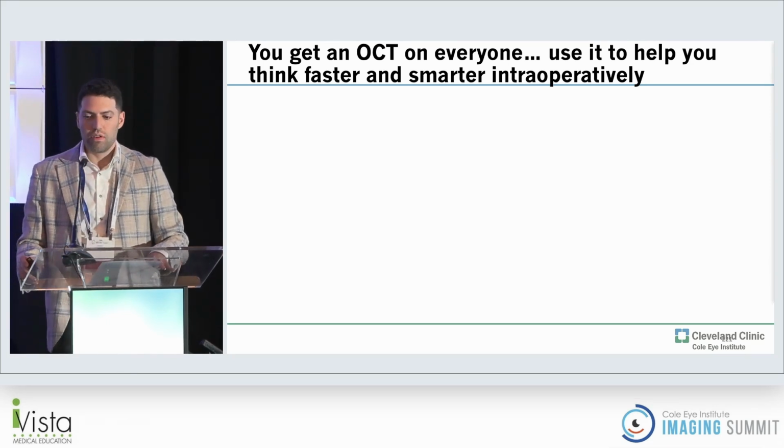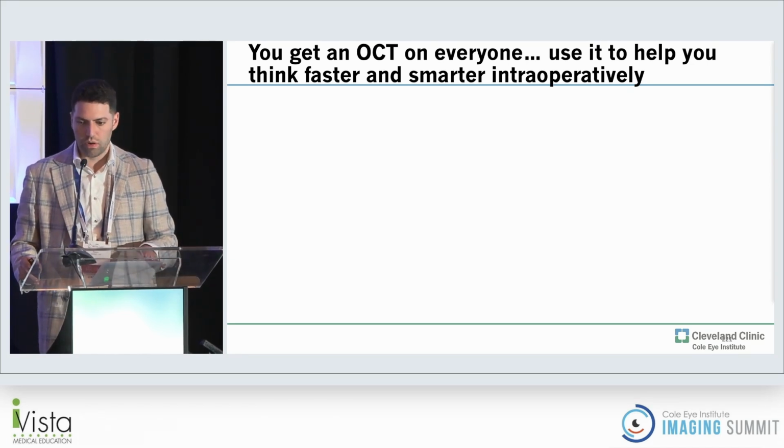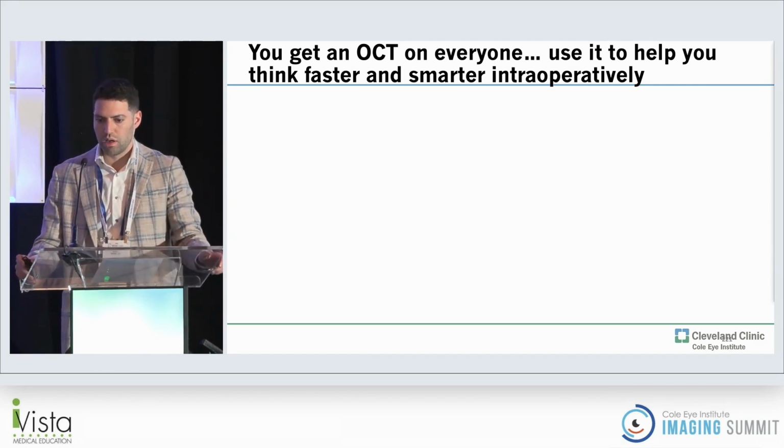We get an OCT on everybody, anyone that walks in the door. So I recommend you use it to help you think faster and smarter intraoperatively. My scrub tech basically knows if I'm opening Kenalog for any case. They have it open if I need it, and I know if I need it. I don't open it just for any case.